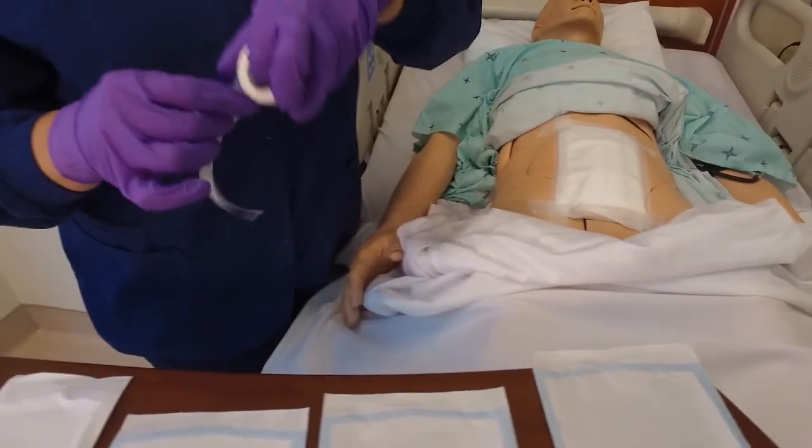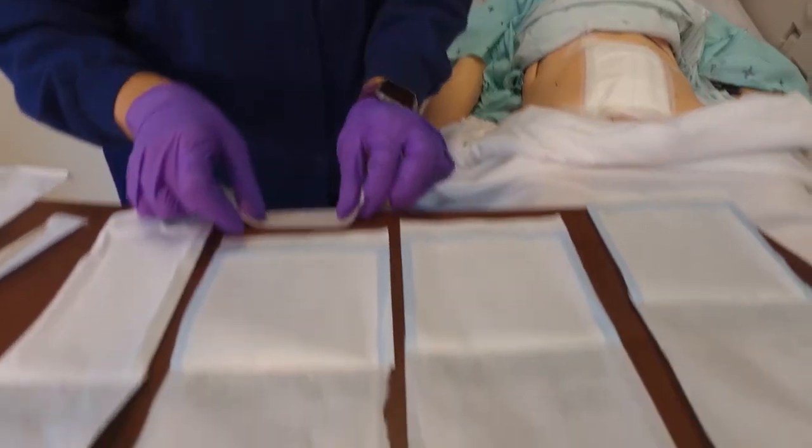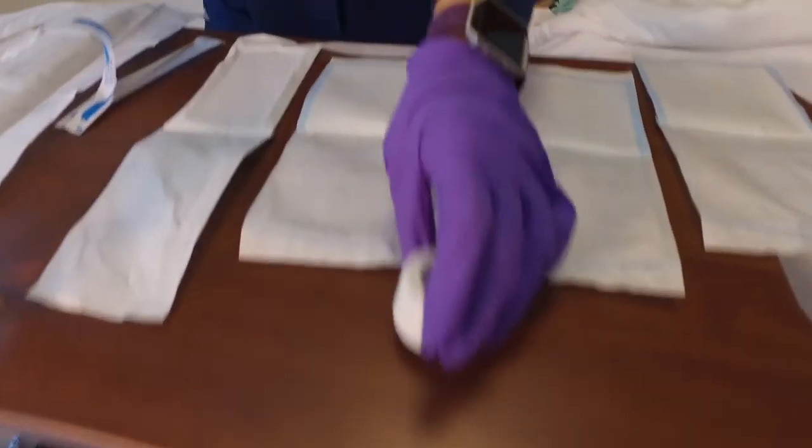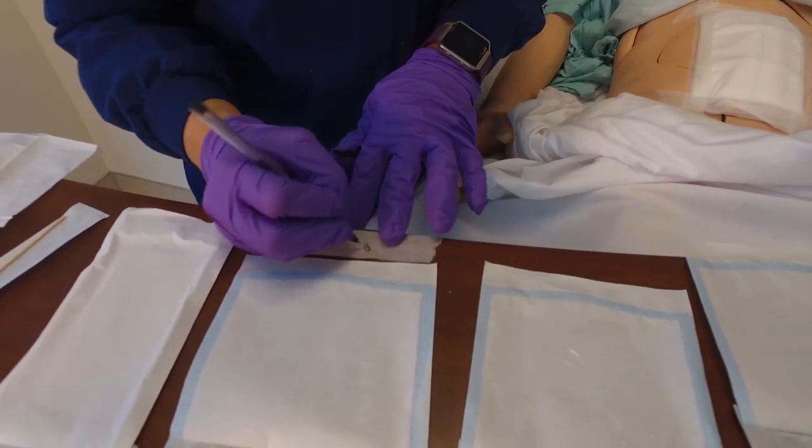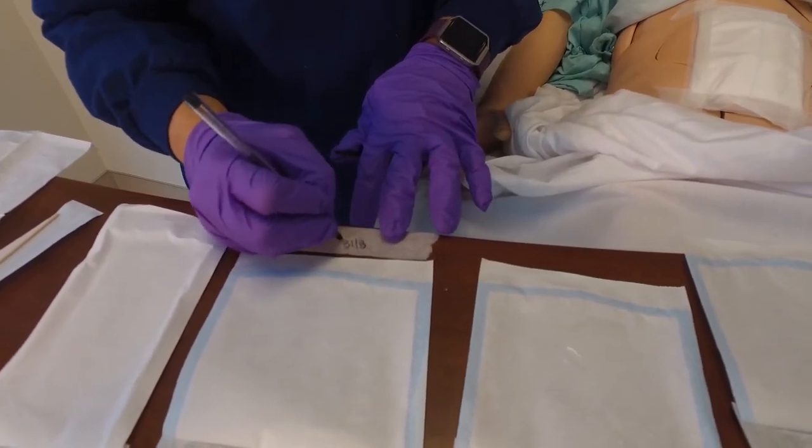The nurse will label the wound by writing the date, time, and initials on a piece of tape and then place it on the dressing.